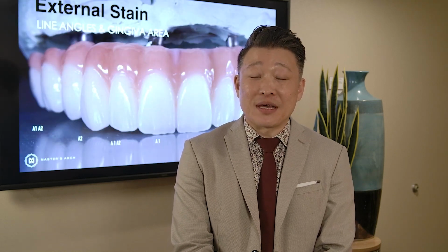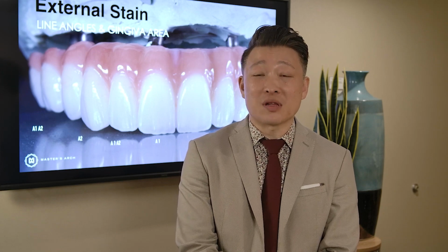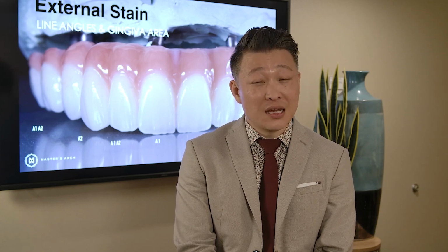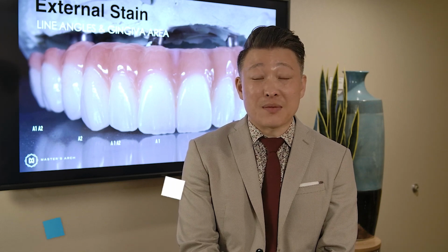So now we're finally onto an external stain. So I basically like to utilize a little bit of value, a little bit of chroma to create a little bit more life-like look. So for instance, for centrals, I like to create a final look of A1, and laterals I kind of go A1.5. Towards the cuspid, I make it a little bit more like A2, and it goes back to A1.5 towards the posteriors. Using a CZR external staining paste, it's really easy to do that, and it's really easy to control.